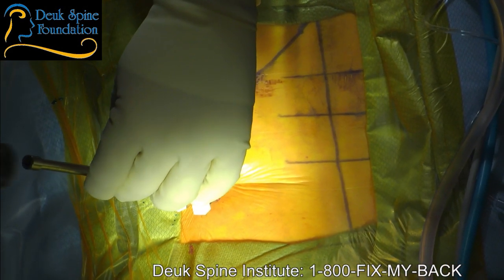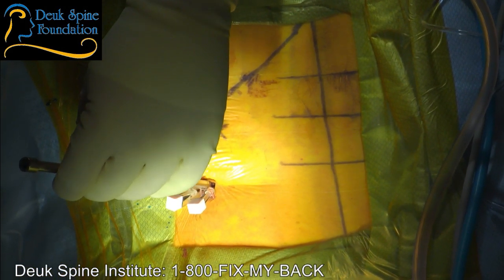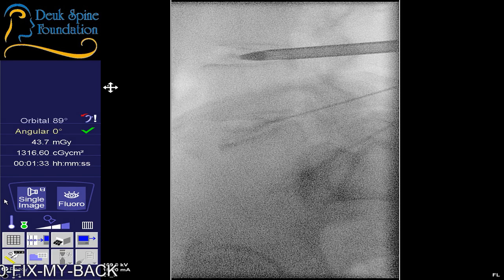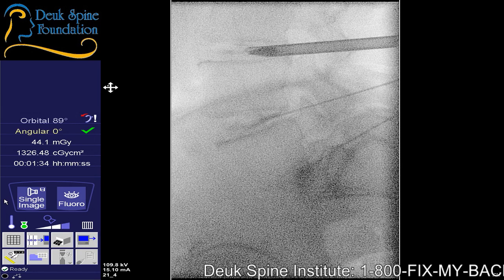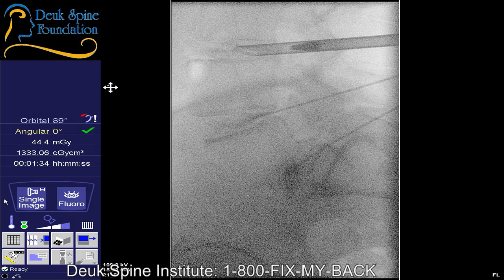I do fusions all the time. They work very well in my hands. But this is a much better surgery because it doesn't involve opening the body and it doesn't involve screws and rods. And he's moving a little bit, so he's feeling discomfort, but again, it's all reflex. He's not consciously aware, he's just reflexively moving because he's using reflex pathways like vestibulospinal pathway, rubrospinal, though that's primarily motor. But I'm very happy with the positioning of our cannula, aka tubular retractor.